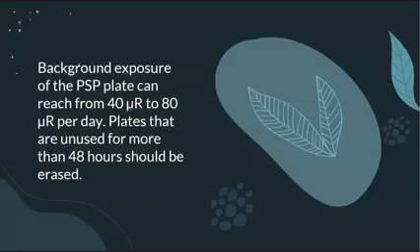Any plate that has not been used for several days will have accumulated sufficient background fog to affect processing and should be erased. Okay? So, of course, yung mga PSP plates na more than 2 days na, it will really affect the quality of the image once it has been used and not been erased before its use. Okay? Any cassette left in the exposure area of a radiographic room should be erased prior to use.